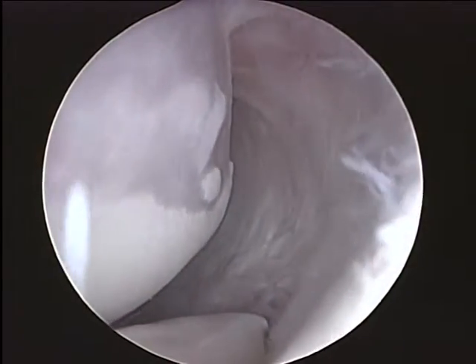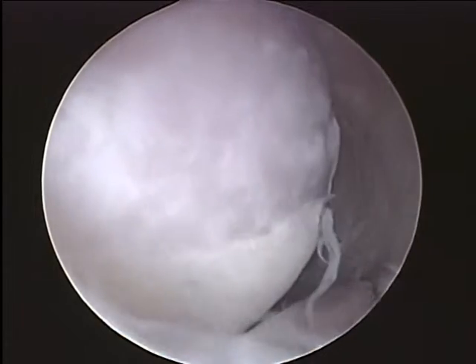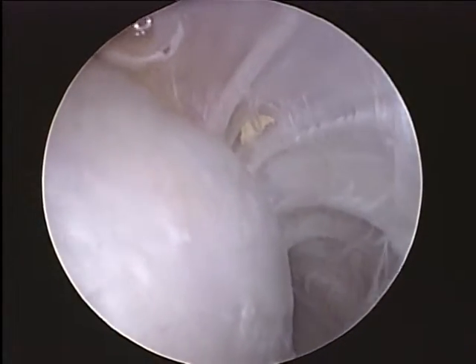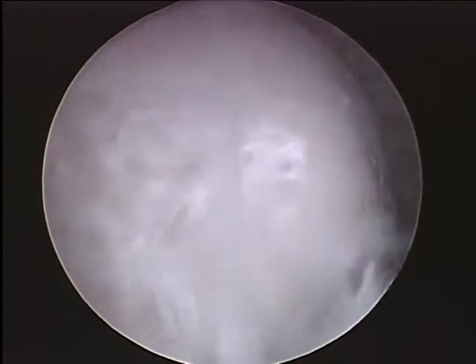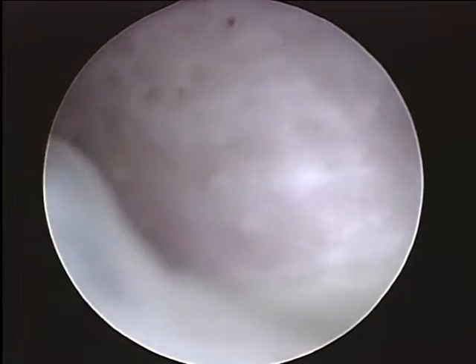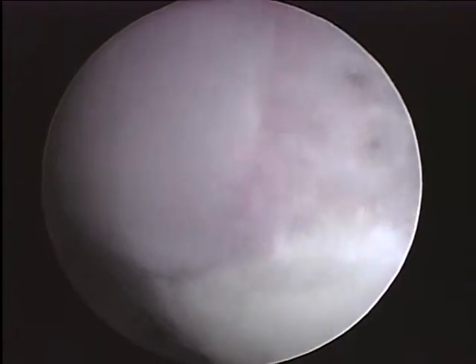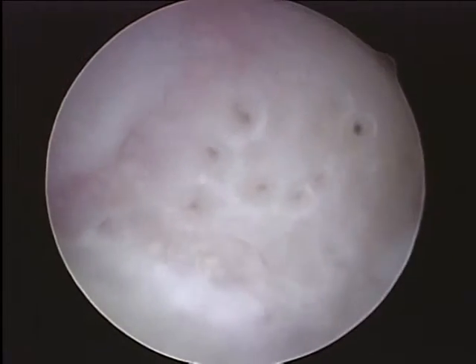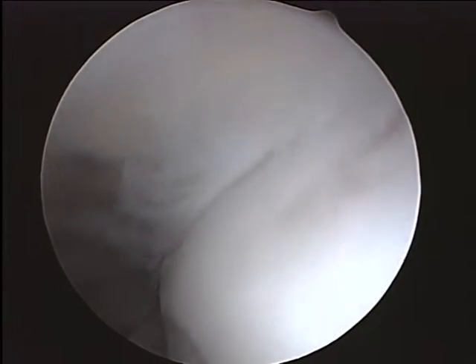Here is the back of the armpit side, the axillary recess, and coming along to the back of the head. Here's the posterior inferior where the capsule attaches to the head, back of the humeral head back here. You did have a little bit of that dent on the back of the head. So this is all consistent with having had the instability issue, although I'm really not convinced that's what's going on causing the shoulder issues now.